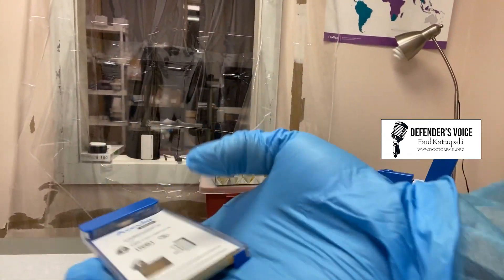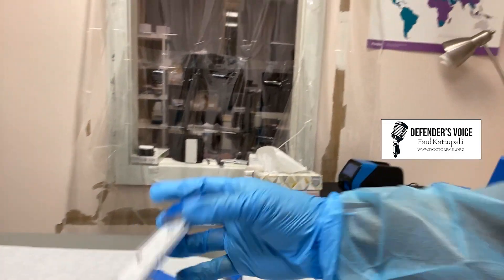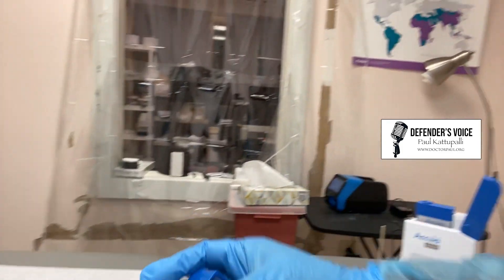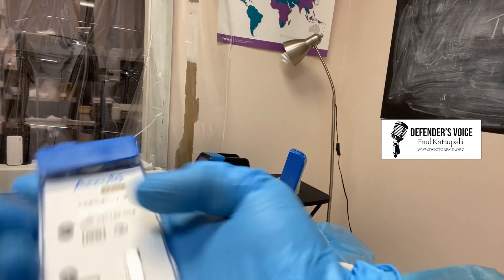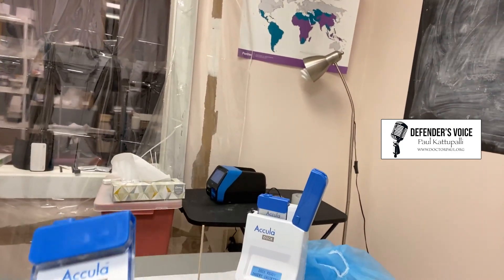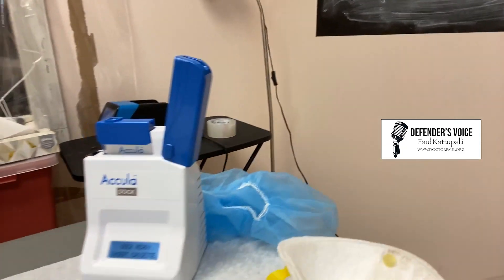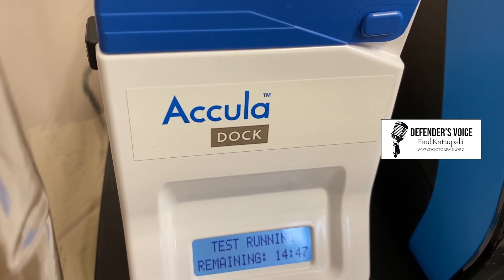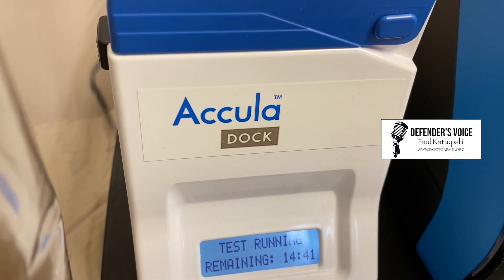Here you are not seeing anything — this means this is an invalid test. And this is a negative test. This machine will help you read the results in 30 minutes; it basically heats up the analyte and after some time you will be able to read the results.